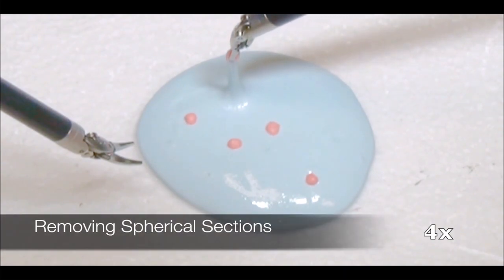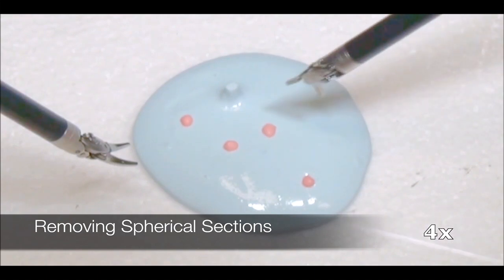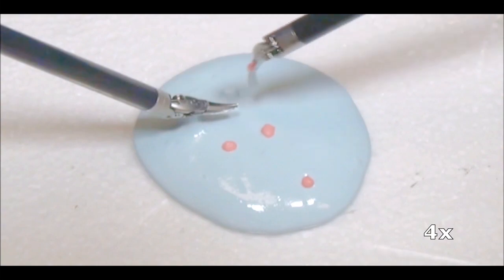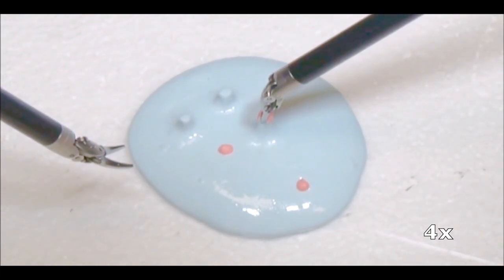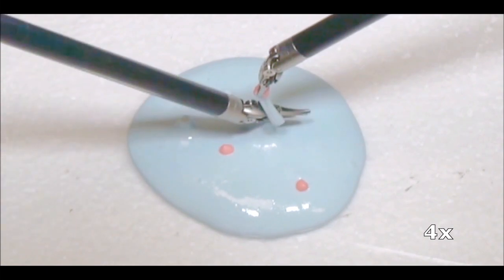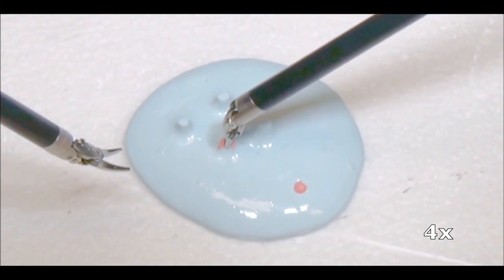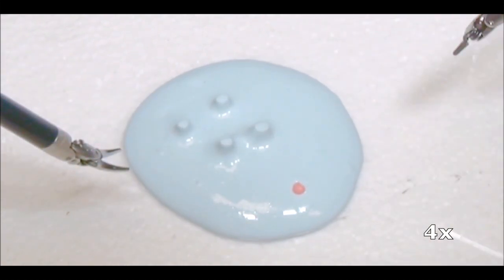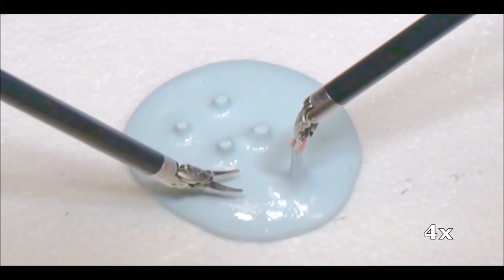The next subtask is spherical debridement, removing a set of randomly placed spherical sections of cancerous tissue. We use plastic putty as a proxy for healthy tissue. Embedded in the healthy tissue are multiple targets made of a viscoelastic material shown in pink. These targets represent damaged or tumorous tissue. A computer vision system identifies the target spheres and guides the robot to extract them. In 50 trials, the robot achieved a 96% success rate.